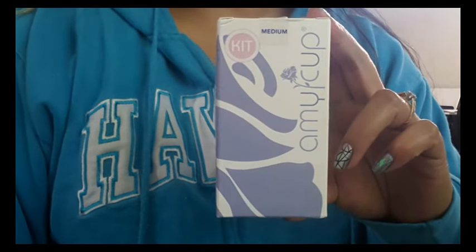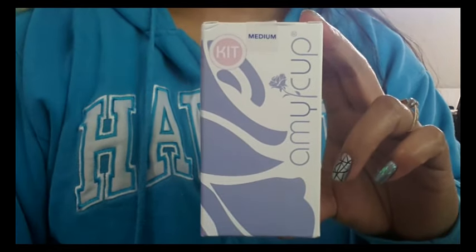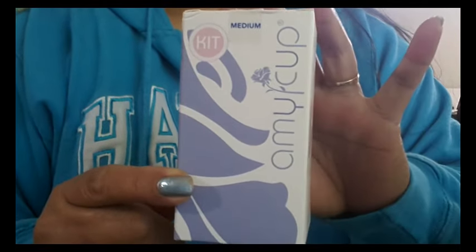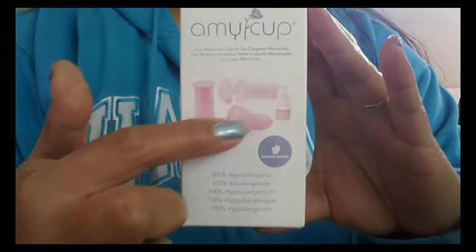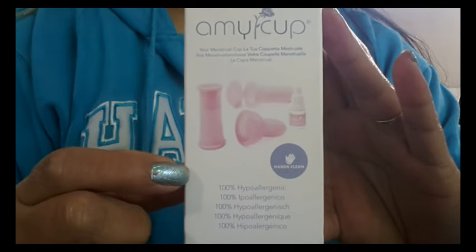Hello everyone! This video is about the Amy Cup Original Kit, and this cup costs $43.66 USD. I'm going to do a quick turnaround of the box — you can pause it if you want to. Here are the items that you receive in the box, and notice that it says 'hands clean.'